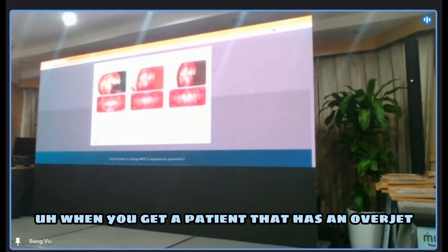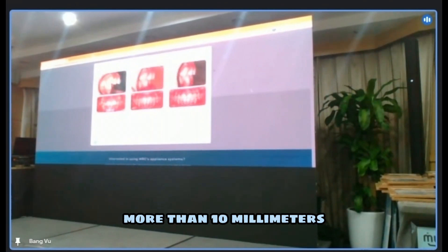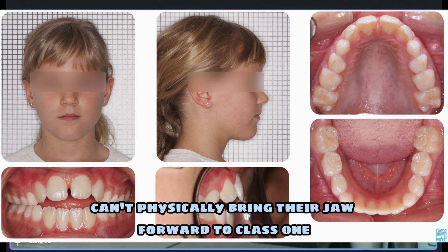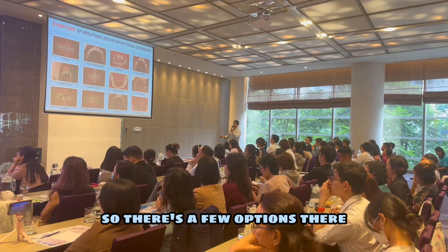When you get a patient that has an overjet more than 10 millimeters, not always, but sometimes, my brace is very difficult to stay in because the patient just can't physically bring their jaw forward to class one. So there's a few options there.